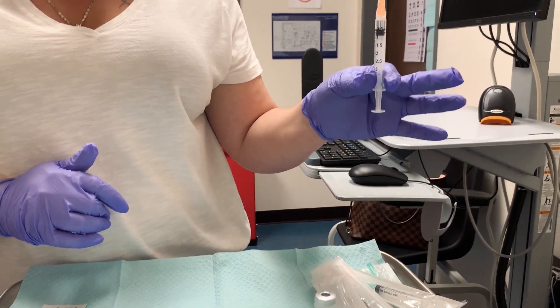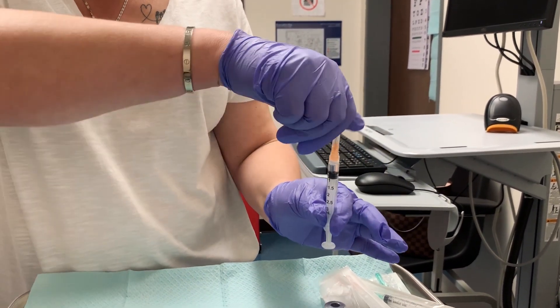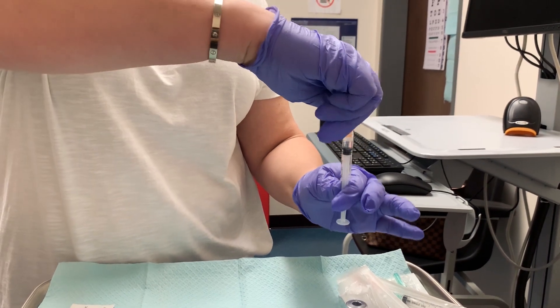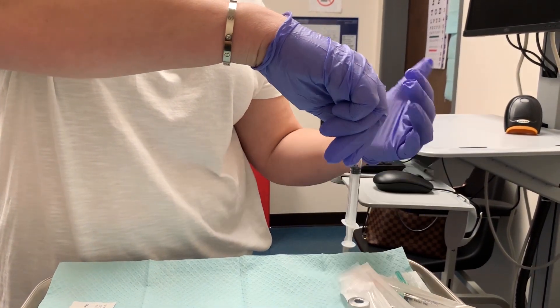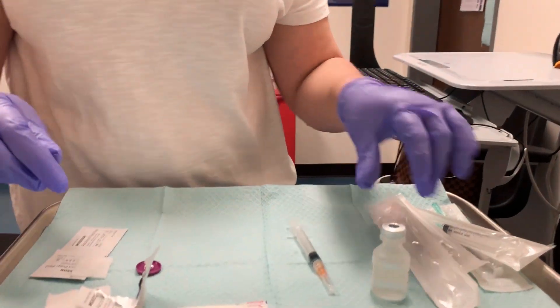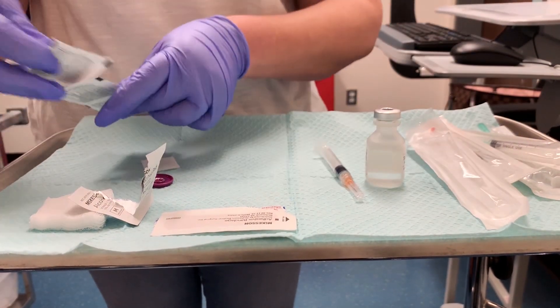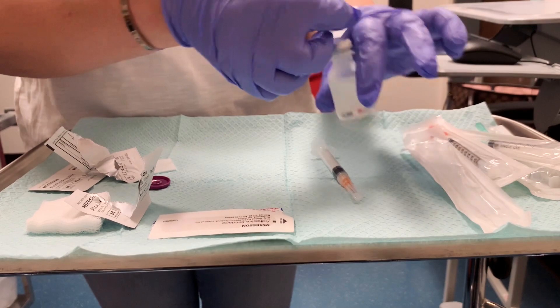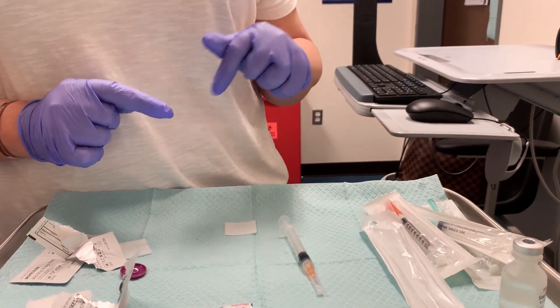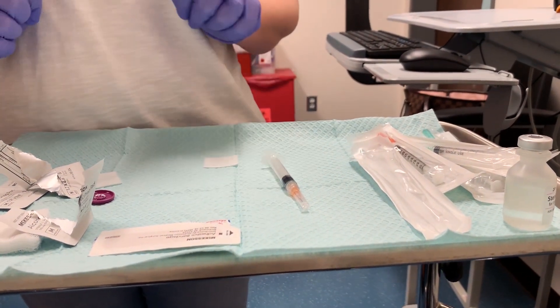The injection is now ready to be delivered. If this was a medication that required a needle change, you would remove this needle and replace it with a fresh one. If it was withdrawn from an ampoule, you would take the filter needle off and put a fresh needle on before injecting. For vial storage: clean the vial before putting it away — it must be cleaned before and after every use if it's a multi-dose vial. If it's a single-dose vial, it's just discarded.